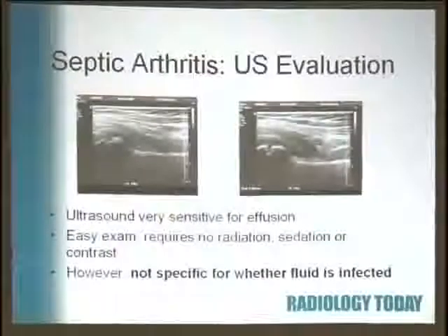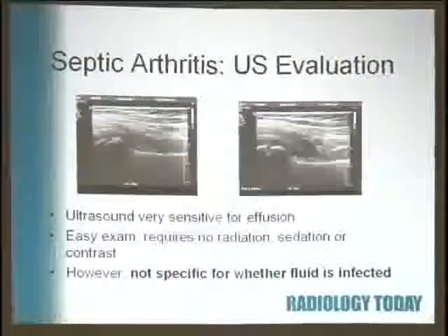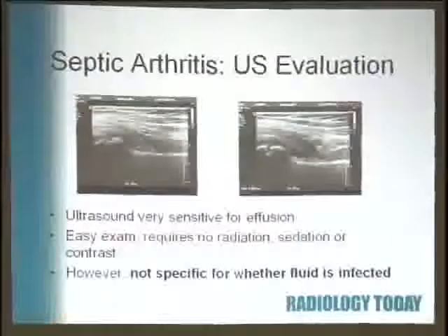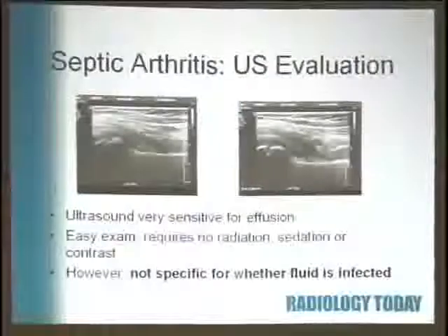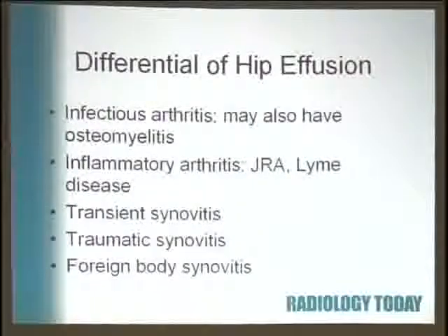Now, it's like looking down into a small hole, so you're very certain about that one area. But it is not specific for whether it's infected or not. So the orthopedists love it, because we can say, we know there's a joint effusion, it's worth you going after it. Although it's getting so that we do a lot of the taps.